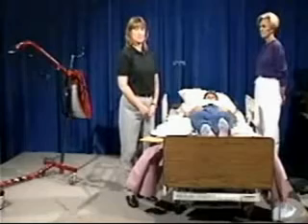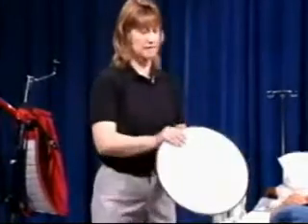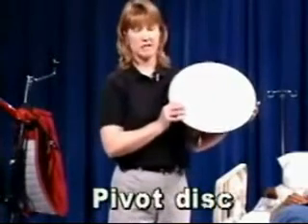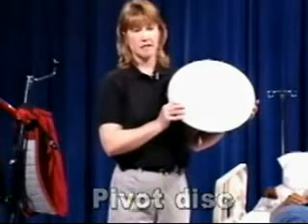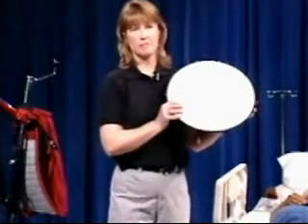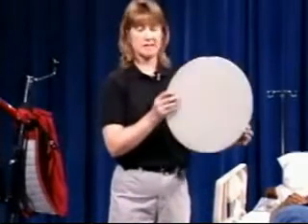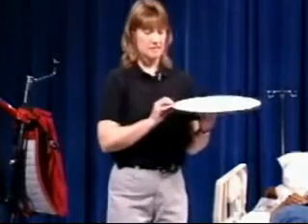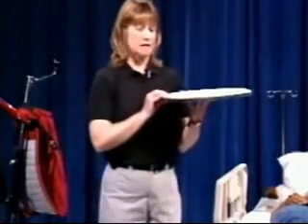There are some devices that you will find when you're working in facilities that are commonly used to help assist you in transferring patients from one surface to another. I'd like to just show you some of these devices so that you're aware that they exist and what they look like. This is what we call a transfer disc or a pivot disc. It may not be used frequently, but in case you see it, you won't wonder what this thing is sitting in the patient's room.